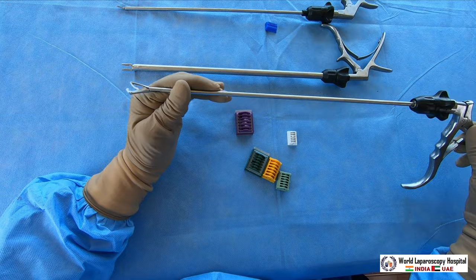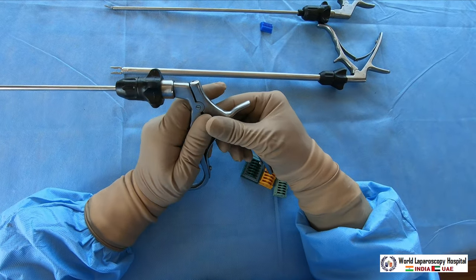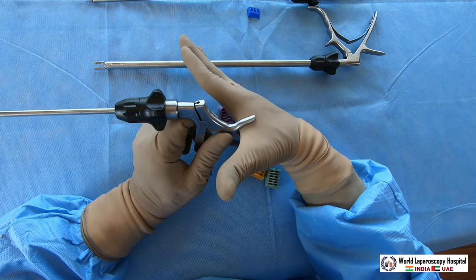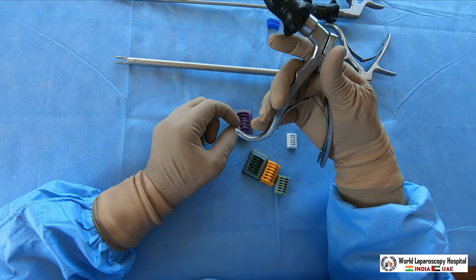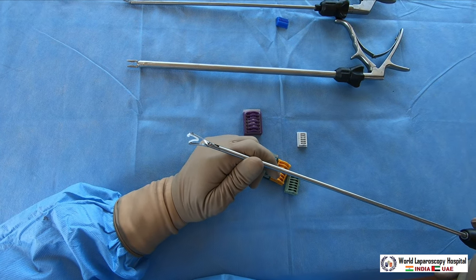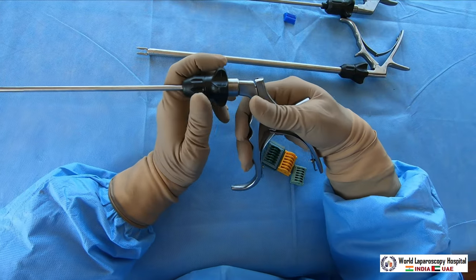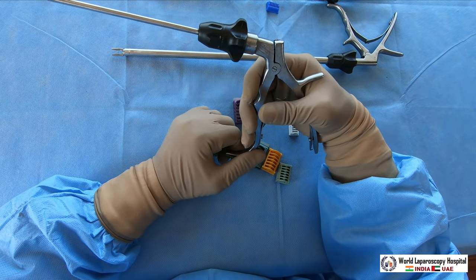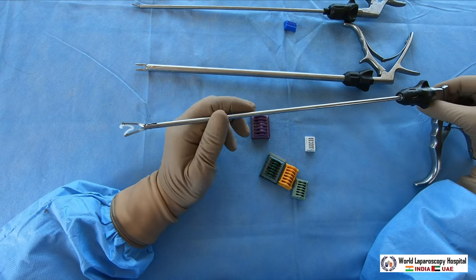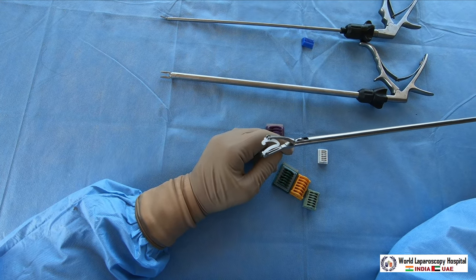That's why it is called Hemoloc. During introduction into the cannula, be careful that it does not accidentally dislodge — make an arc with the hand to hold it properly. The thumb and index finger rest on the instrument, the grip of the fingers holds here, and the index finger rotates the jaw. The Hemoloc is self-locking once you press it. It can be used for renal artery, splenic artery — it is very useful. It is a little more expensive than titanium but better, because there is no risk of a clip stone, no metal risk, and MRI can be safely performed postoperatively.